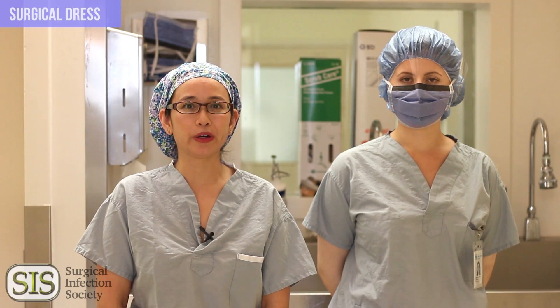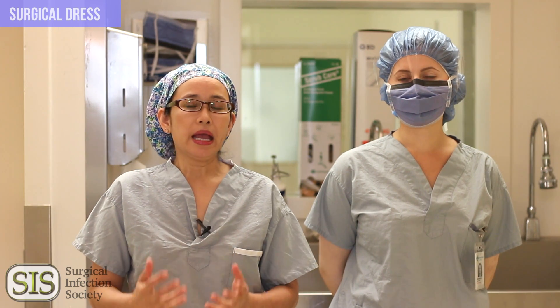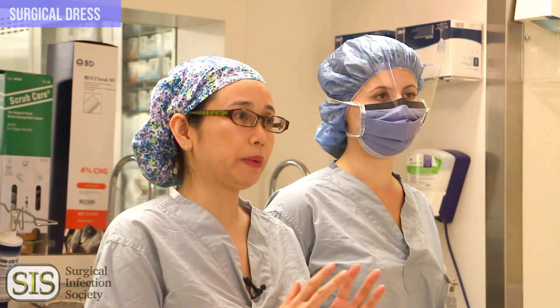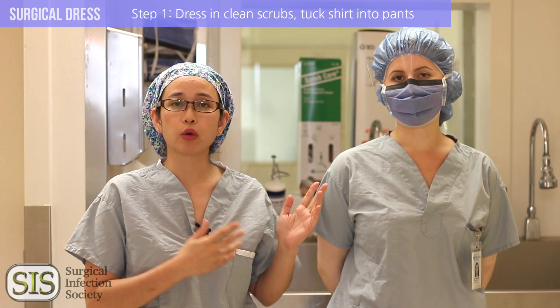Stephanie is a medical student from the University of Alberta and she's going to demonstrate the steps on how to do a scrub. We've broken it down into 8 steps on how to prepare to do a scrub and 8 steps on how to do the actual scrub. Number one: start off with having clean scrubs for the day.